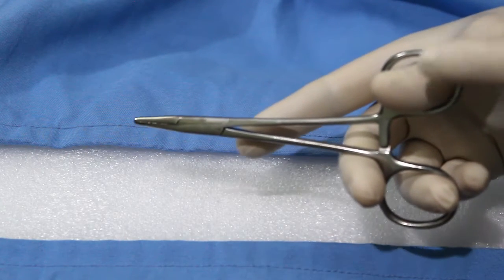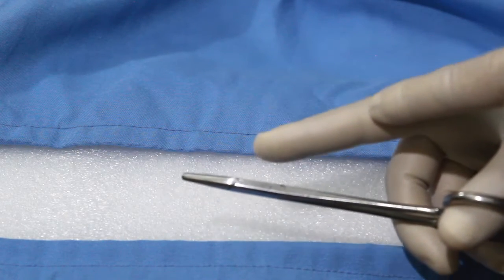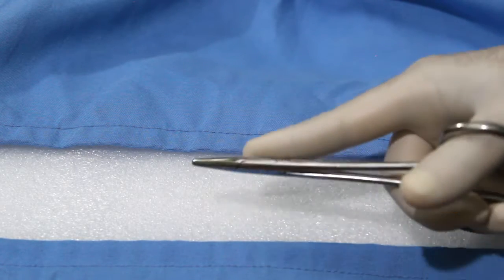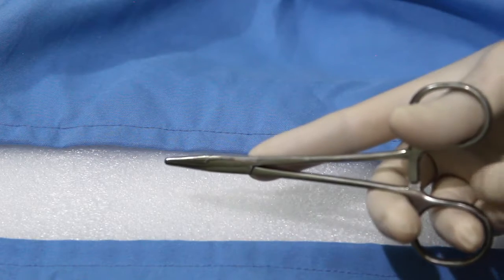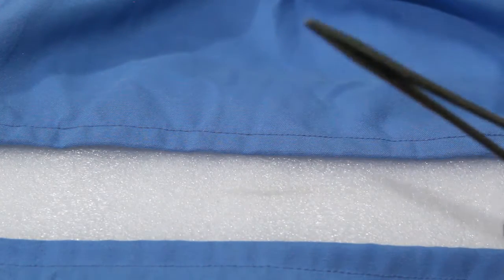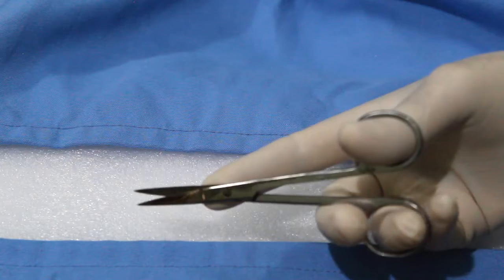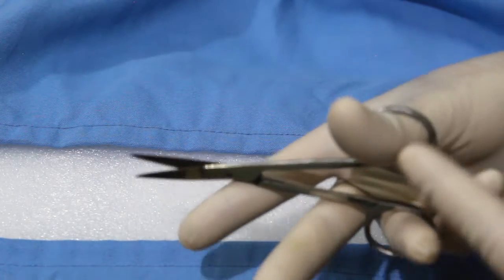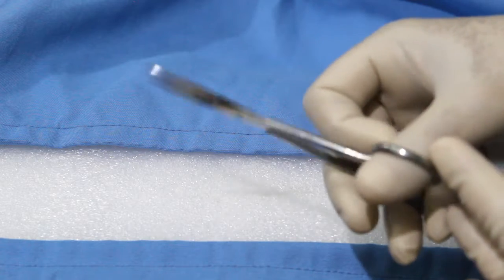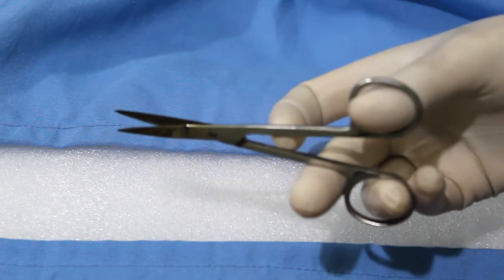Always use the tip of fingers, and use the index finger along the length of the needle holder to provide stability and control. This applies not only to the needle holder — when you hold scissors also, use the same technique. Only insert the tip of fingers.